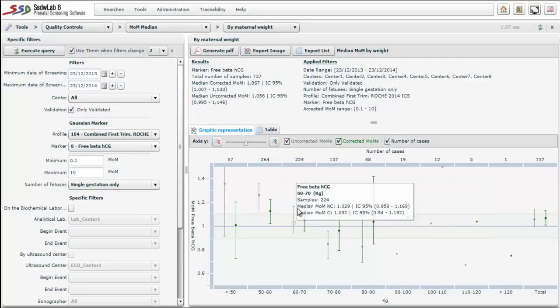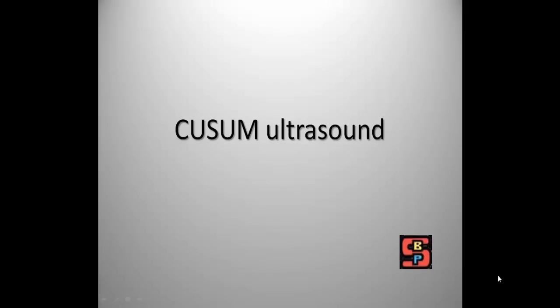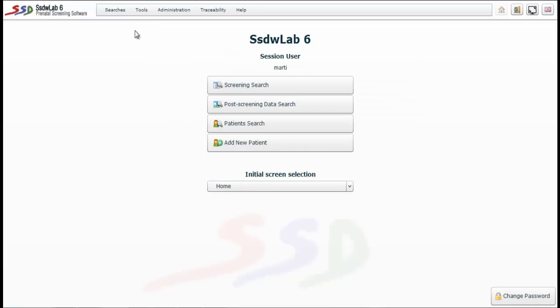Our program allows calculating these corrections automatically. Finally we will analyze the CUSUM — the cumulative sum of the deviations from the obtained value regarding the expected value. CUSUM is a very important quality control for ultrasound measurements, specifically for the nuchal translucency, because it allows us to assess in a very reliable manner the quality with which these data are obtained from different sonographers.